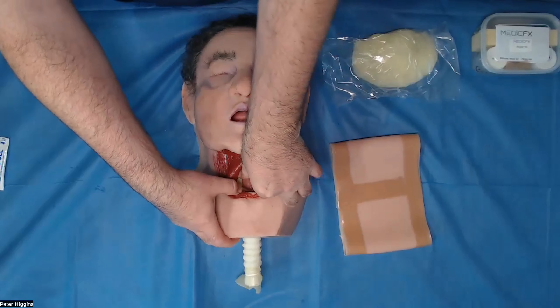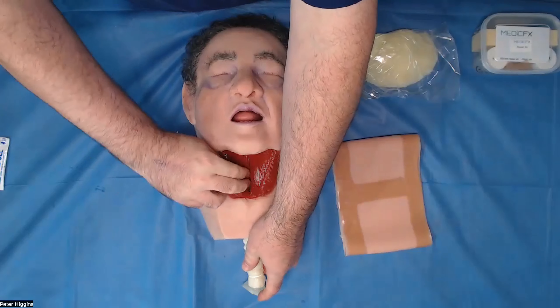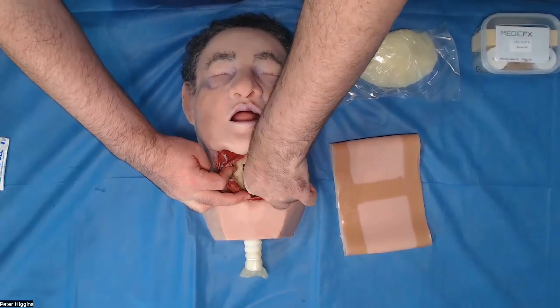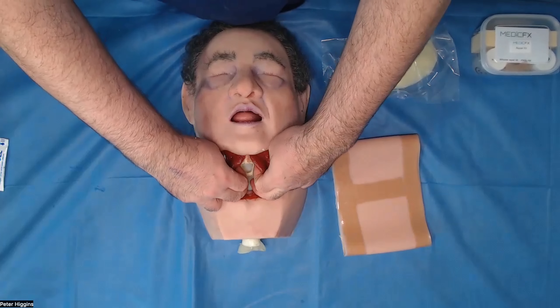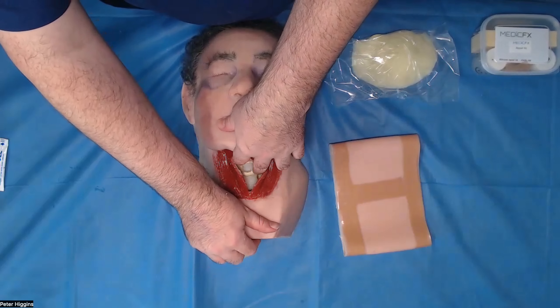Open your neck skin up so that you can see when the trachea has finally made its way up. It's a reasonably tight fit, so it might take a little bit of effort and you may need to use your fingers inside encouraging it up. You want the trachea to fit nice and snug up against where the vocal cords would be — the laryngeal opening at the top here.